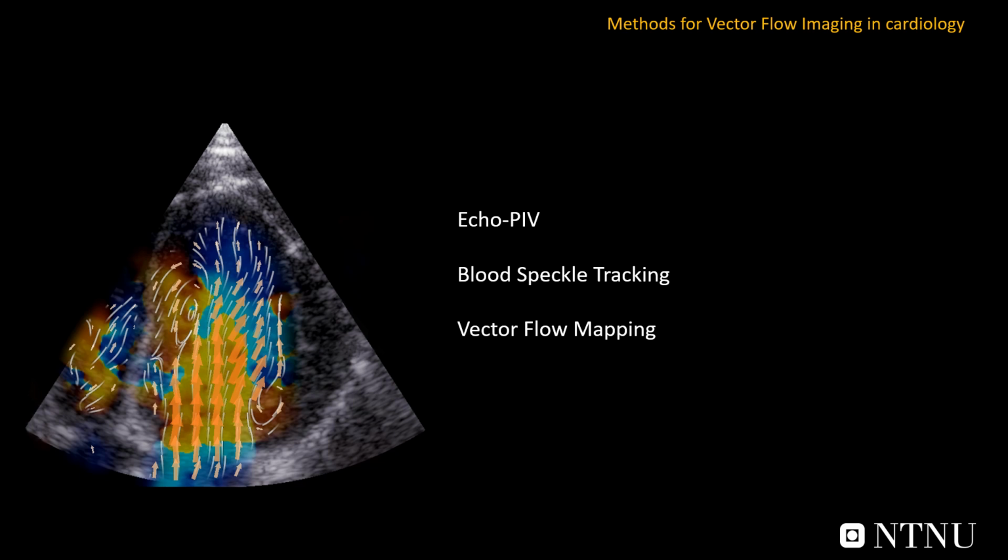In blood speckle tracking, you avoid the use of contrast agents and track the speckle pattern produced by the blood cells themselves. But with the low intensity of the backscattered echo from blood, and especially when transmitting with broad beams, sufficient clutter filtering is important to suppress the strong signal from the tissue and reveal the blood speckle.